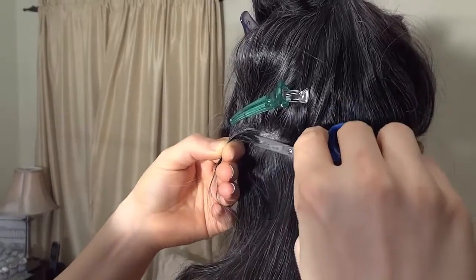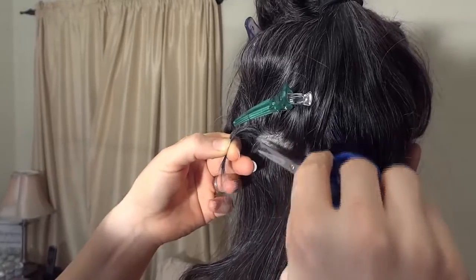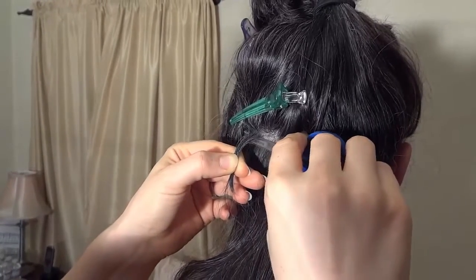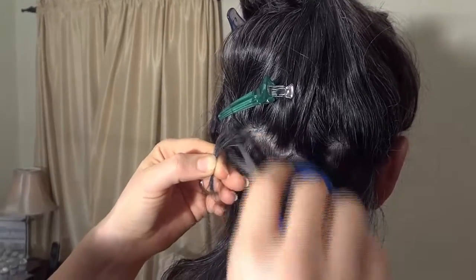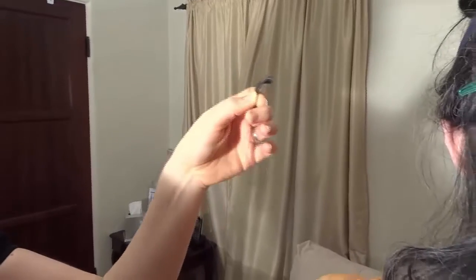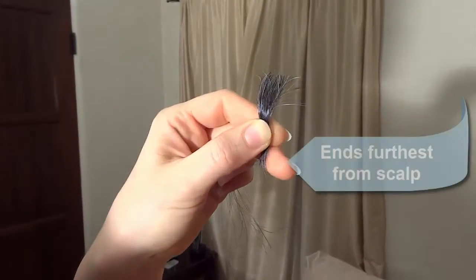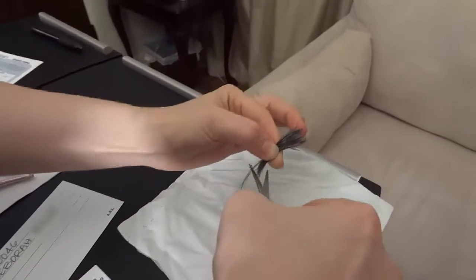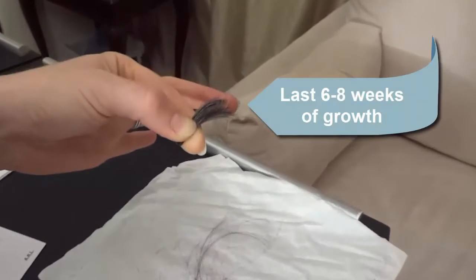You'll want to remember which end of the hair was up against the scalp and which end was furthest away. The hair up against the scalp is the most recent growth. The hair we are cutting here is a couple of inches long. For purposes of doing a retest, the most important information is the most recent information. So we are going to cut off the long ends of hair that were furthest from the scalp so that instead of averaging 4 months of body chemistry changes, we are now only getting the last 6 to 8 weeks.